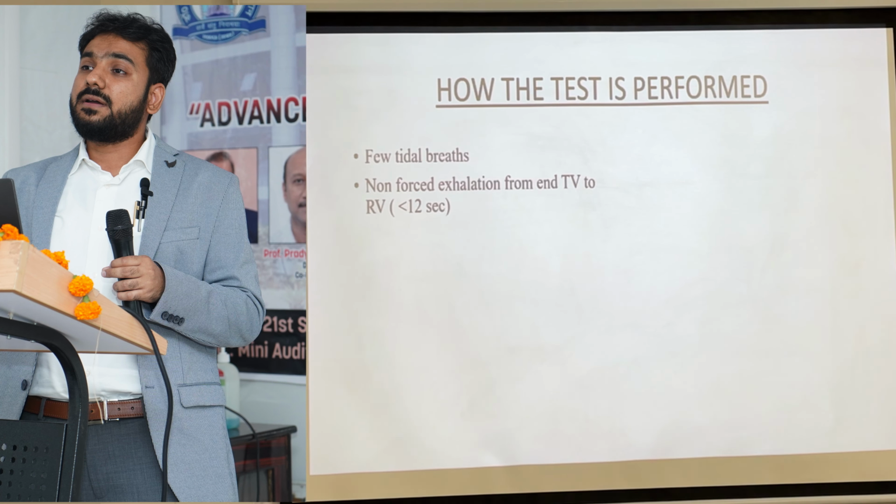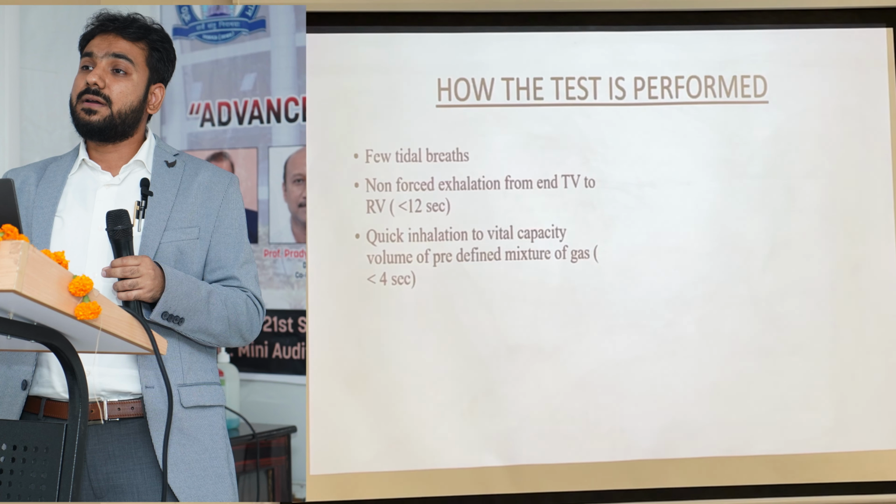The maximum time given in the ERS guideline is 12 seconds. In obstructive patients, they will take a prolonged time to empty their lung to reach the residual volume, and it has to be non-forced. If you are forcing, it might lead to early collapse of the small airways, so they are not getting ventilated. So this has to be a non-forced exhalation down to the residual volume. Then the third step is a quick non-forced inhalation to the vital capacity of this predetermined gas mixture that we just talked about. This process from RV to TLC should usually be done in less than 4 seconds. But again, this has to be quick but non-forced.